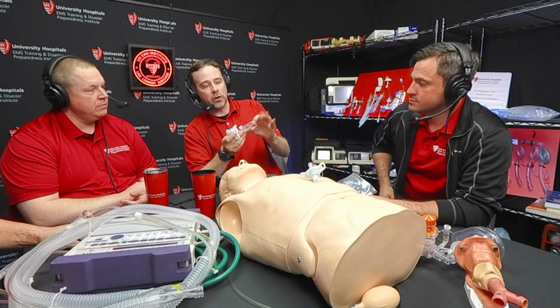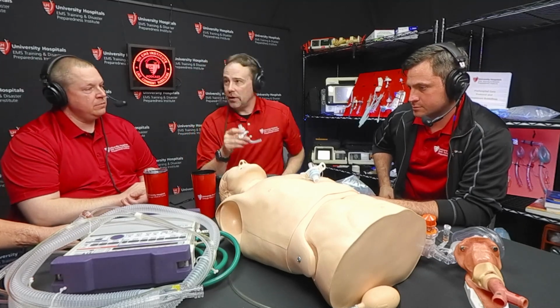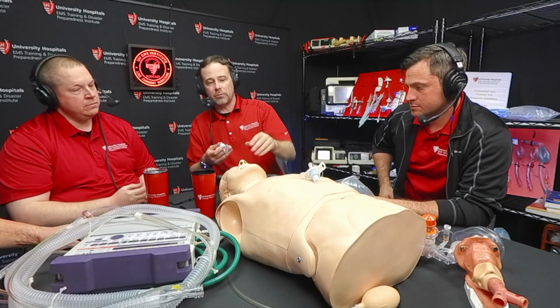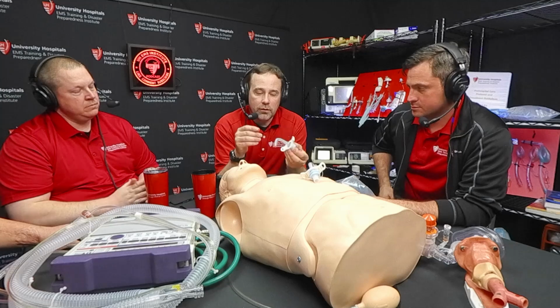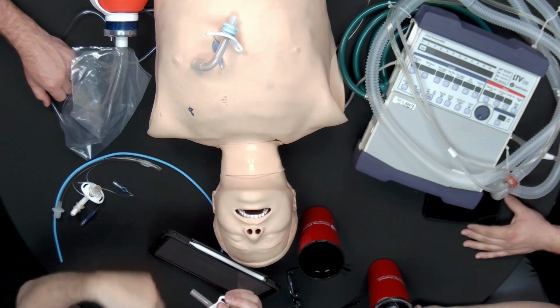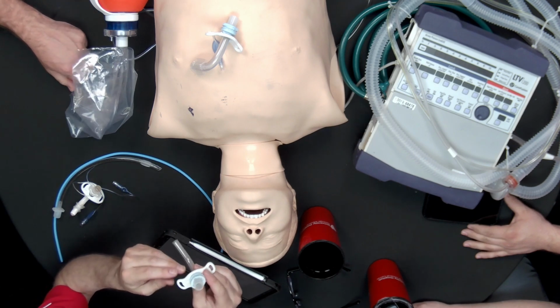is generally pretty short, because right at the end of this, of course, here's my sternal notch. Carina is going to be right about there. So we need to, of course, have this above the level of the carina, so we ventilate both lungs. So these patients, often this just sits in there, and usually they've got some sort of Velcro strap or some sort of a tie that goes around the back of their neck.